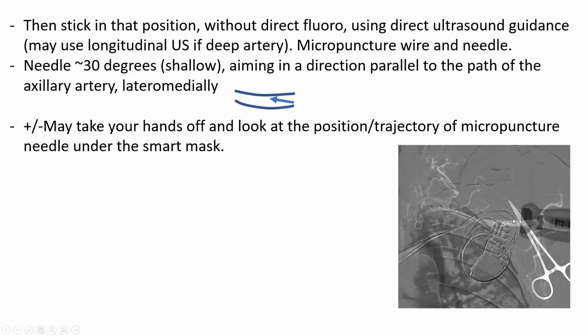So after I've identified my position, I stick under direct ultrasound guidance. I use the 4 French micropuncture system, a wire and needle. And this is the angle of the needle. Like I said, 30 degrees in that lateral-medial plane. I could use longitudinal ultrasound, usually not in a patient with an ICD, as there is no room for that.